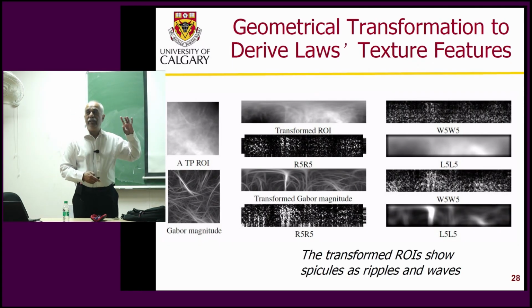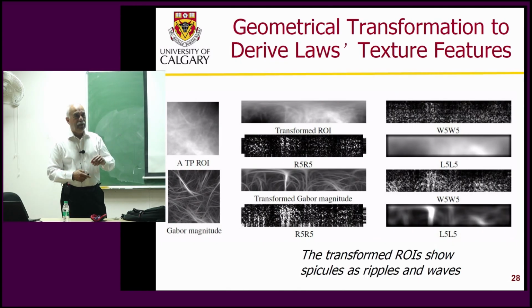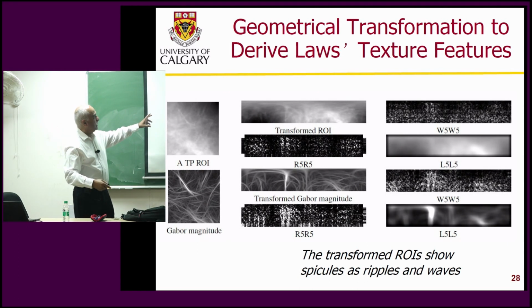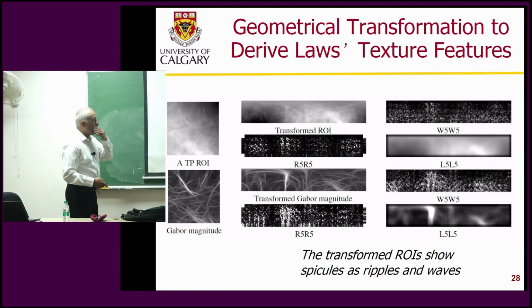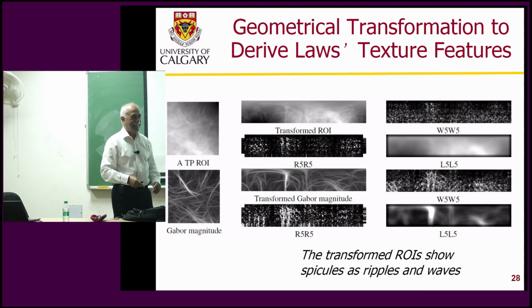Similar to the rubber band stretching transformation of Sahiner and others that I showed earlier, where a ribbon around the mass is transformed to a rectangle. But here this is a Cartesian to polar transformation. It is polar, but we are displaying it as a rectangle. Sorry about that noise, I don't know what is causing it.